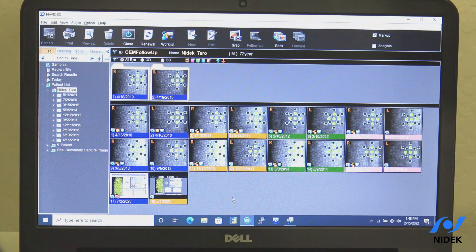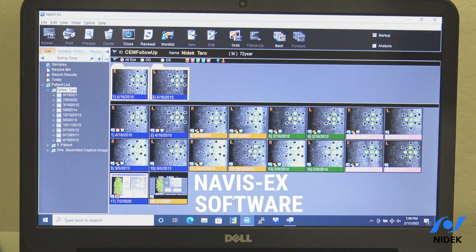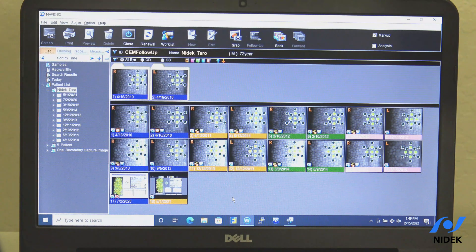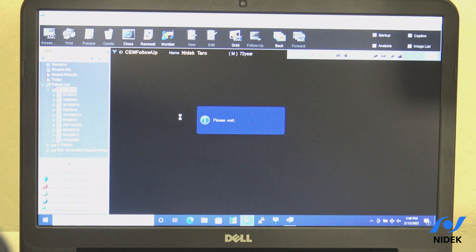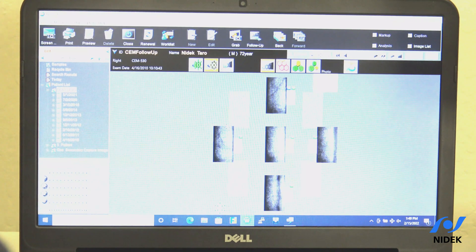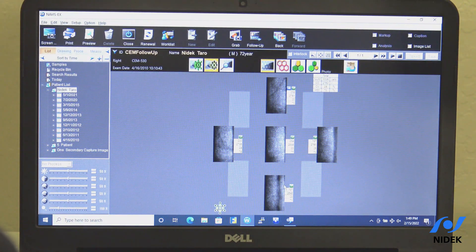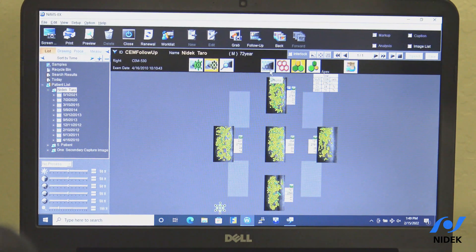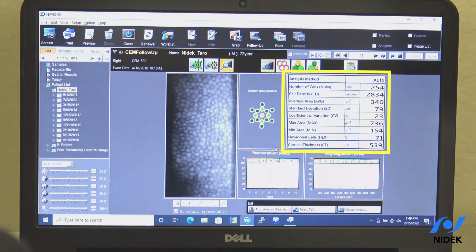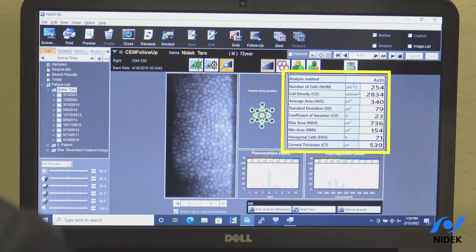In addition to the standalone CEM530 and software, we also offer the Navis EX software image filing platform. This stores patient data and can be used to perform follow-up to look at progression over time. If I double click on the right eye, it gives me the same type of analysis as the standalone unit. We've taken central and four paracentral images. We can also utilize area, apex, trace, and photo views. Double clicking on the central area gives the same data from the standalone unit, and this data is stored within the software and can be reviewed repeatedly.